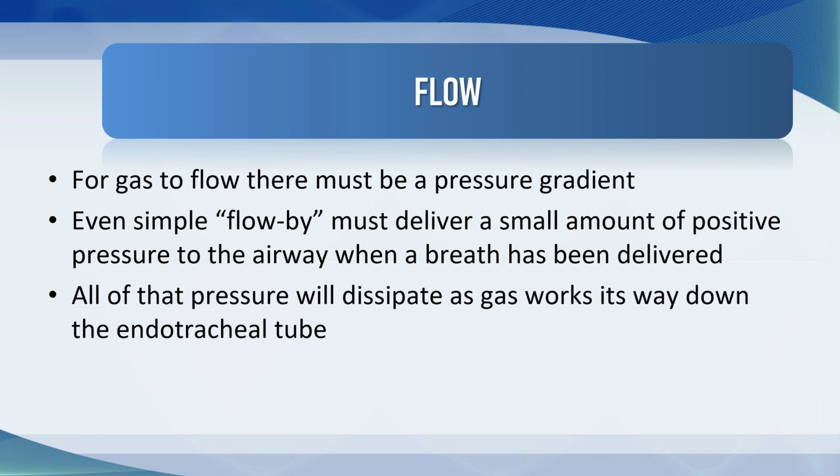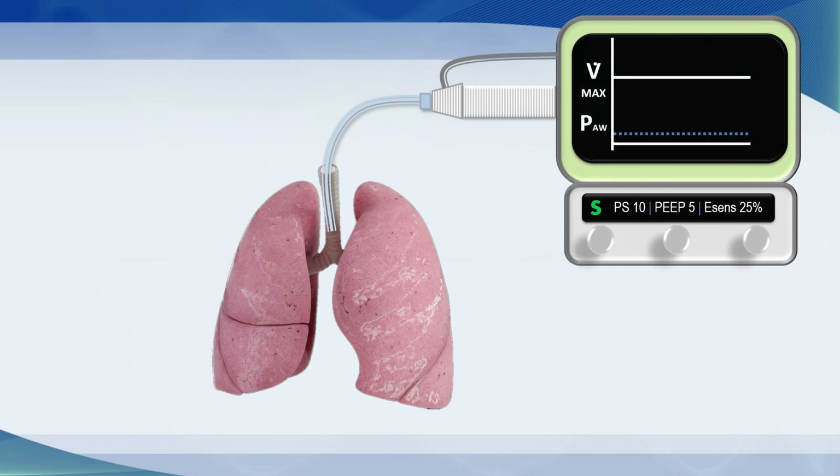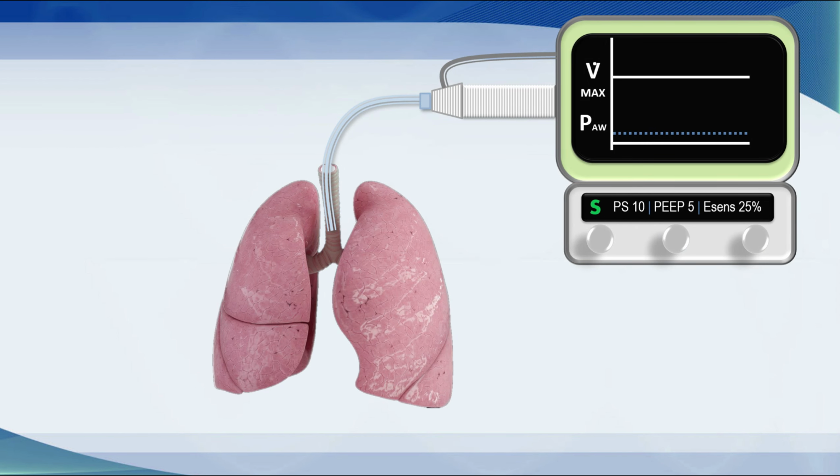A lot of that pressure will dissipate though as gas works its way down the endotracheal tube. In this example, you can see that I've attached a pressure and flow sensor cable to the Y.